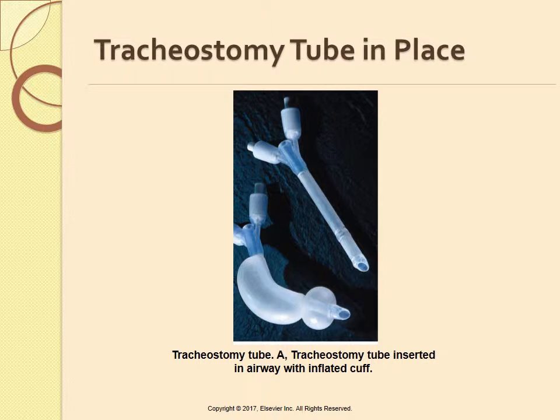Here is a picture of a tracheostomy tube. One has the balloon and one does not.